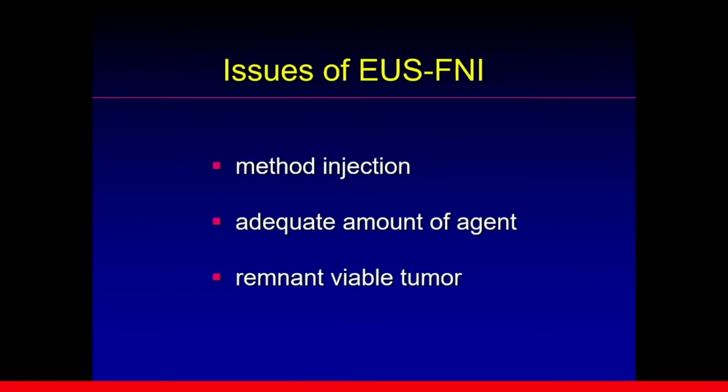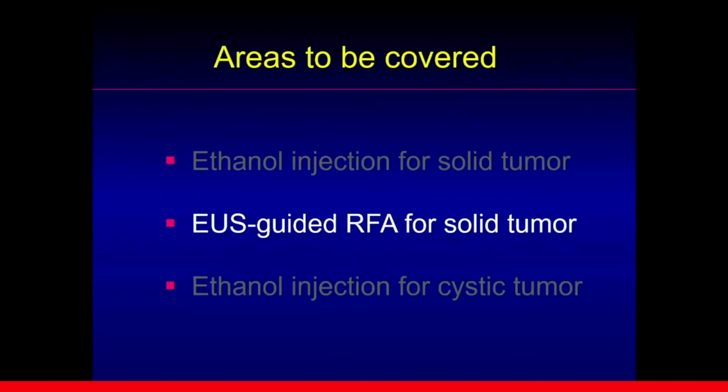But there are still issues on this technique. The method of injection is not standardized yet. The amount of ethanol is not calculated scientifically. It is empirical treatment. Remnant viable tumor is another issue when we target the larger tumor. Let me move on EUS-guided RFA.